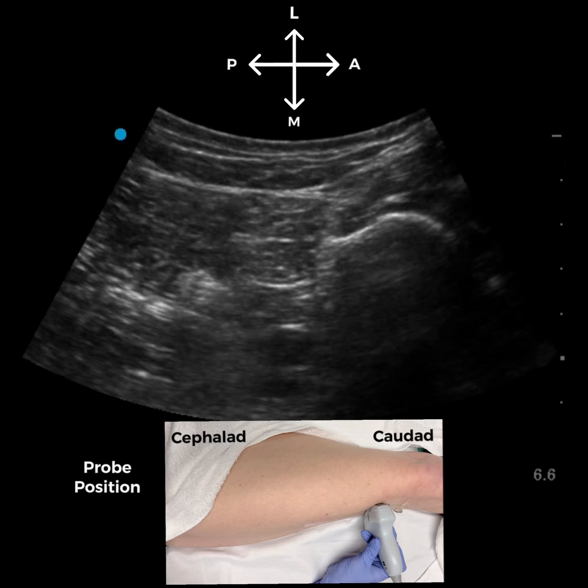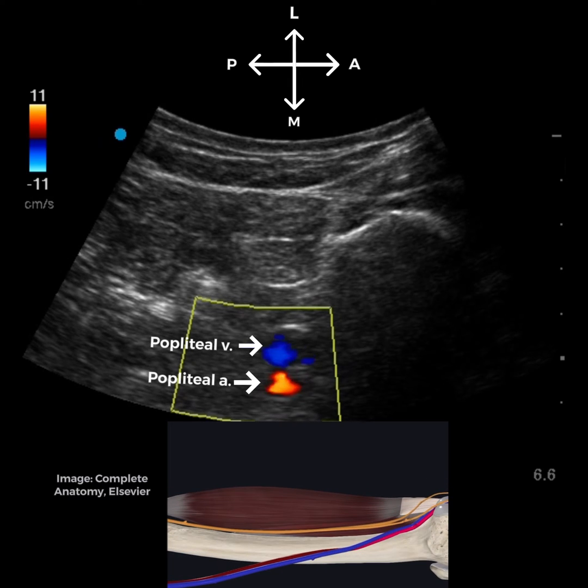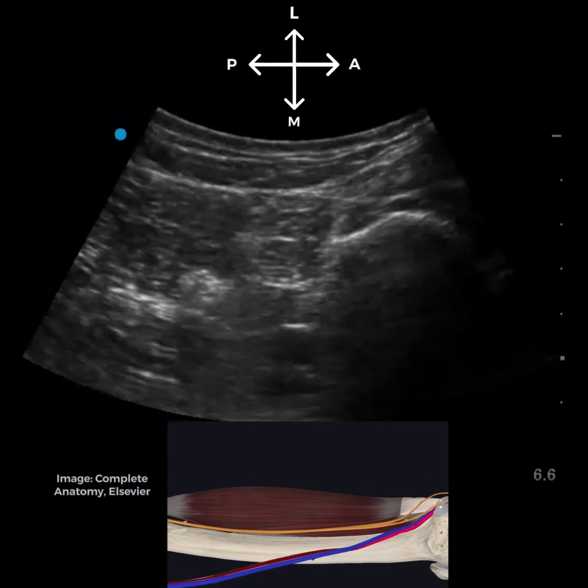We place the curvilinear probe on the lateral side of the leg in the transverse orientation just above the knee. Here we can identify the hyperechoic line of the femur, and posterior to the femur, we see the bright sciatic nerve beneath the biceps femoris muscle. The popliteal vessels are seen between the femur and the sciatic nerve.